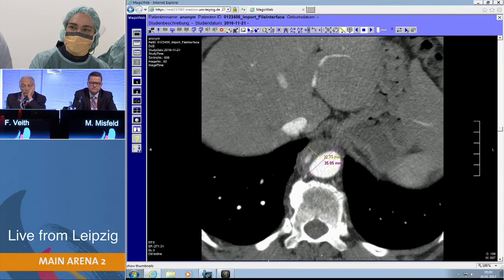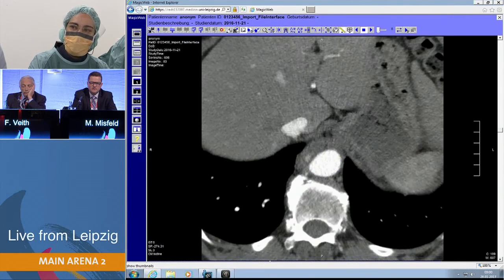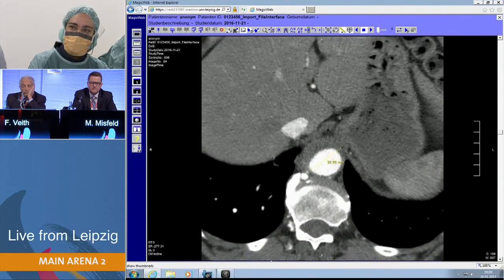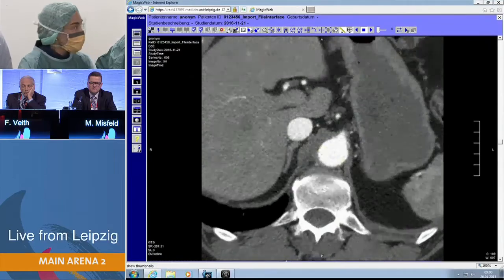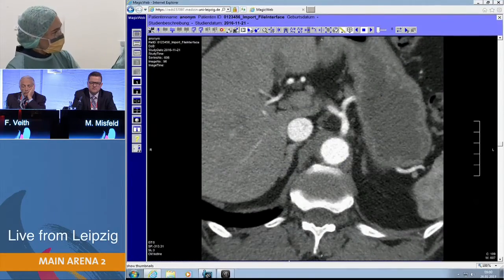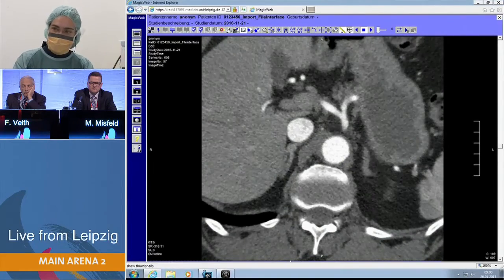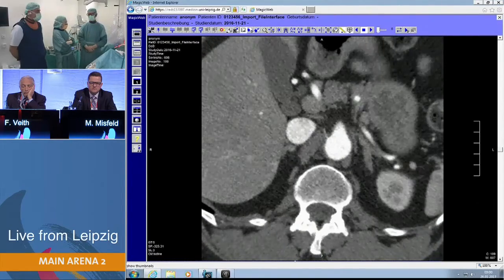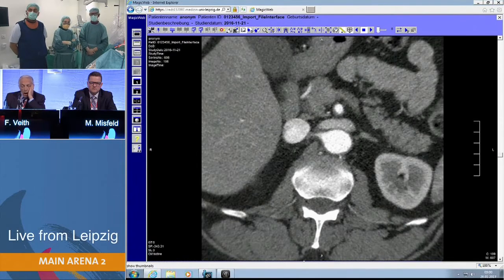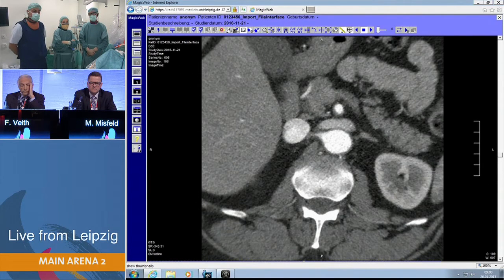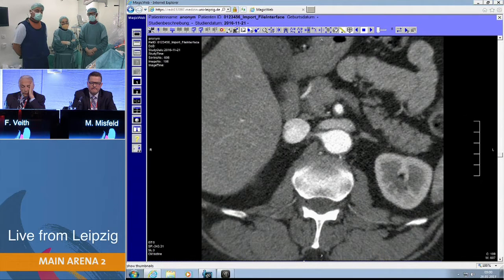This distal dissection pathology is very close to the celiac trunk. When we reviewed this CT, we decided together to completely stent the thoracic aorta, beginning from the left subclavian artery down to the celiac trunk.